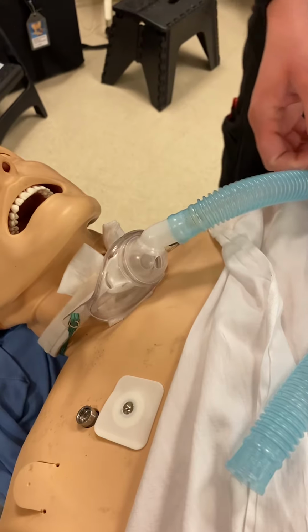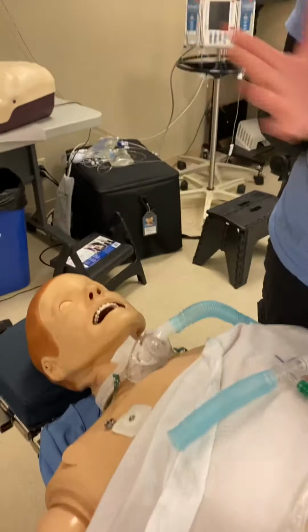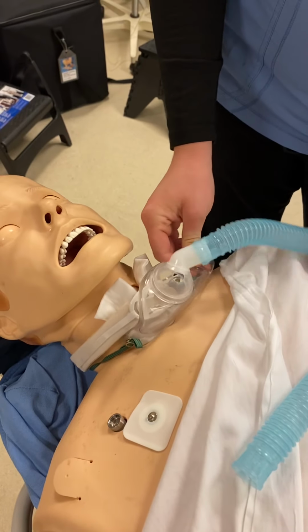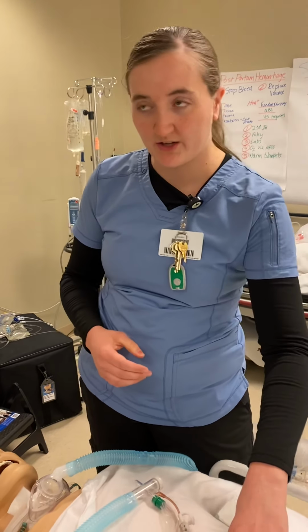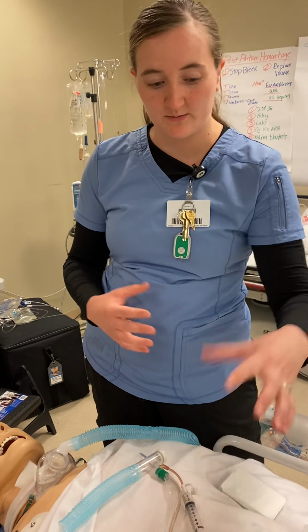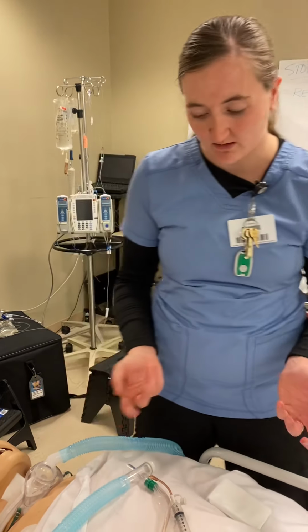Okay, so I will walk through how to change and do your dressing care. Obviously, we're going to have gloves on and we're going to wash our hands. This should be considered a sterile procedure when you're changing out the intercannula and cleaning that. So you're going to want to keep this as clean as possible. Everything else is just a clean procedure. So you're going to put clean gloves on, not sterile gloves.